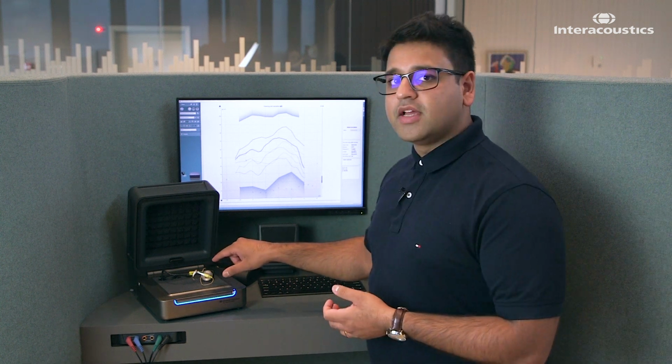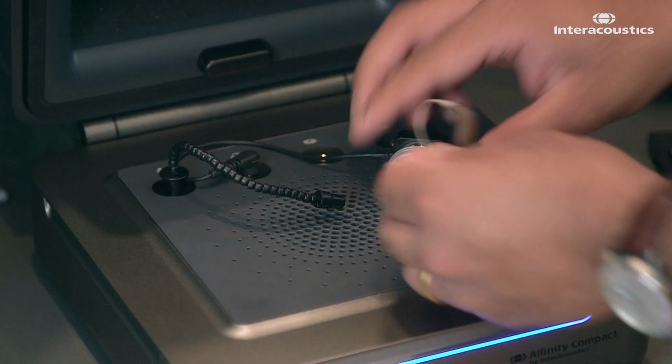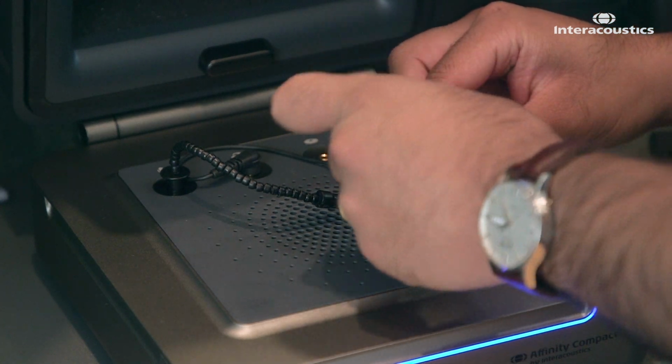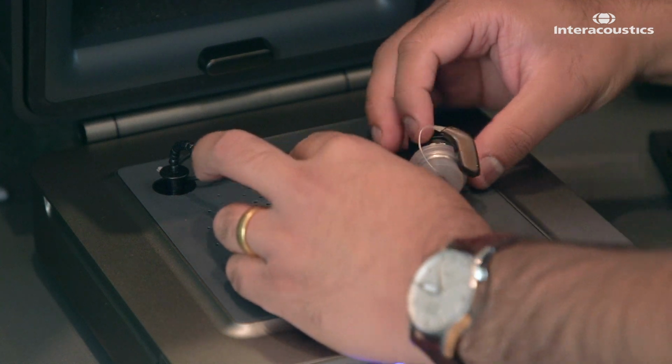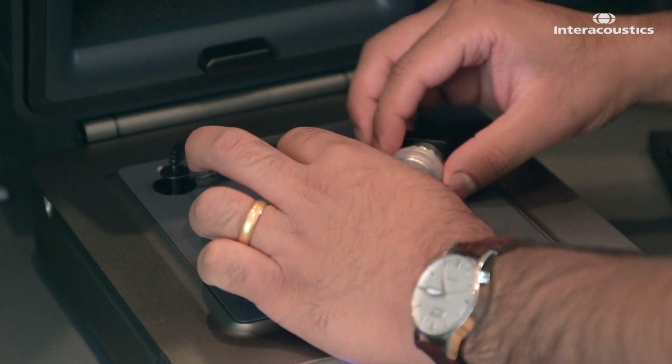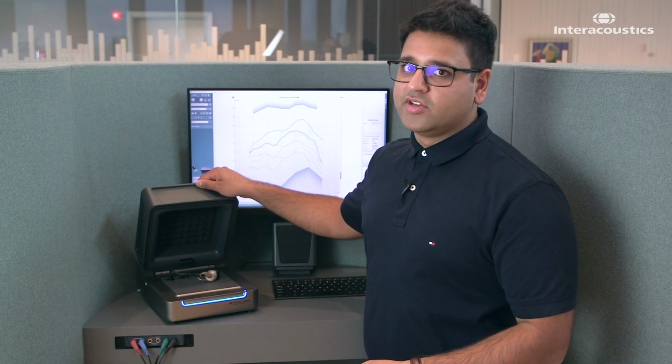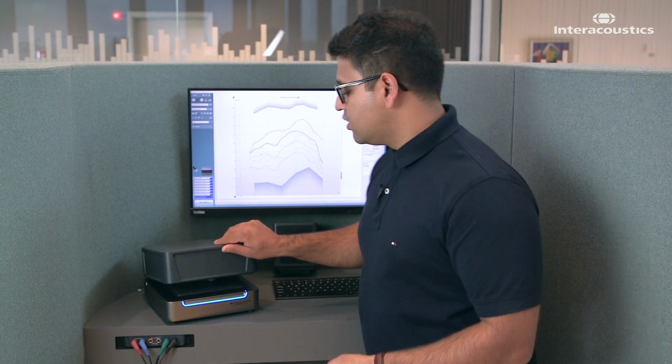We'll now change the hearing aid in the box to the new hearing aid that we're going to fit for the patient. And now we can go ahead and make the measurement on the new hearing aid to then fit it against the existing and previous hearing aid's output. So we're keeping the audibility that they like, yet we're upgrading them to the new technology of the newer device.